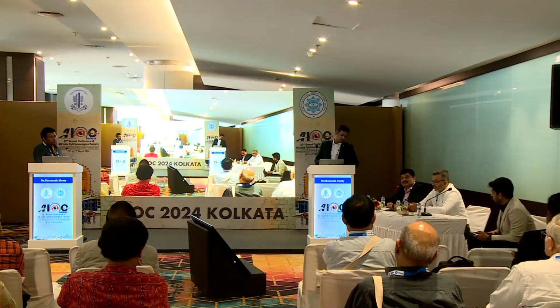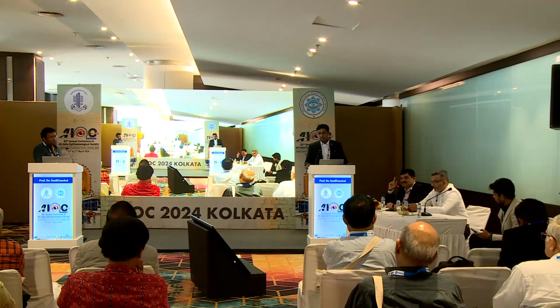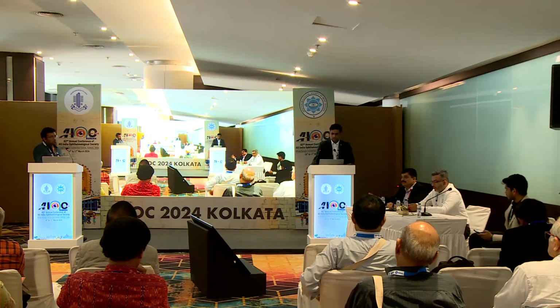In one eye I put a monofocal on the dominant eye, and in the non-dominant eye I put a multifocal. Even though she had a very large pupil, she never complained, because her dominant eye is very happy. She could see for distance. Always knowing the dominant eye is very important.